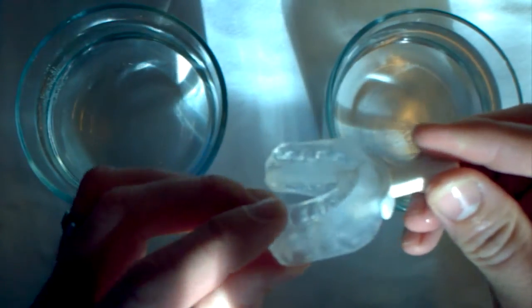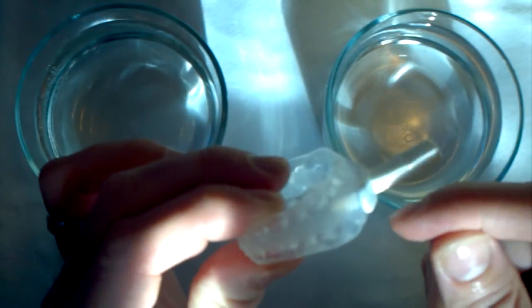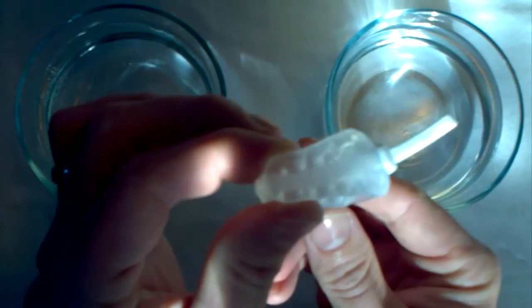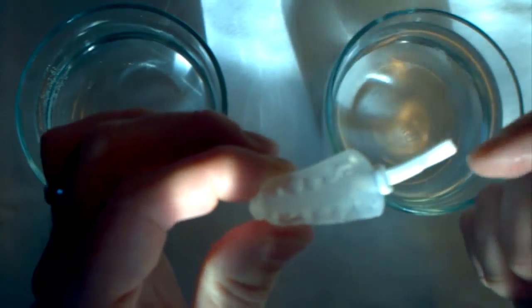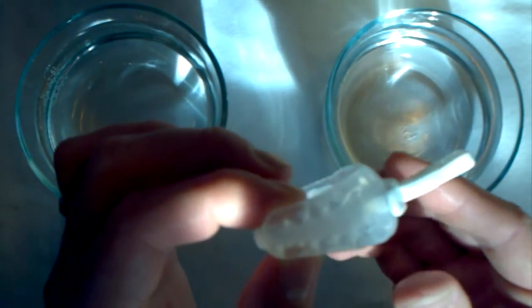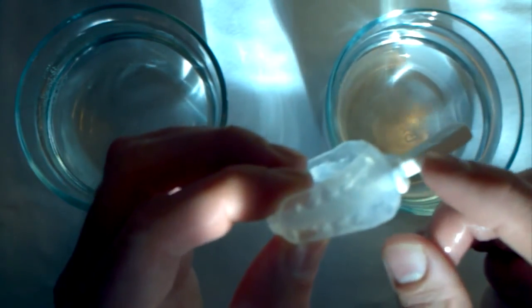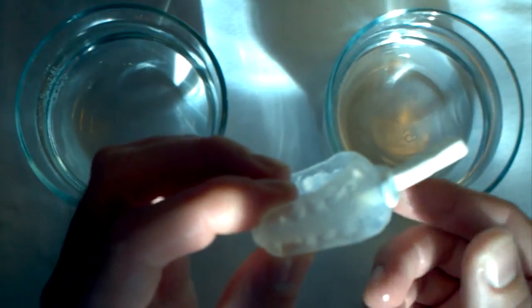As I mentioned earlier, whenever you're forming this mouthpiece, you're going to notice that this plastic air spacer is going to bend up at a slight angle. And if you can see here, it is facing upwards slightly. So this lets you know basically that you've done it correctly as far as fitting it and moving your jaw forward. This is something you want to make sure you have. Otherwise, as I mentioned, the mouthpiece is not going to work.